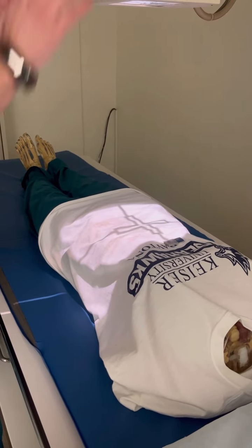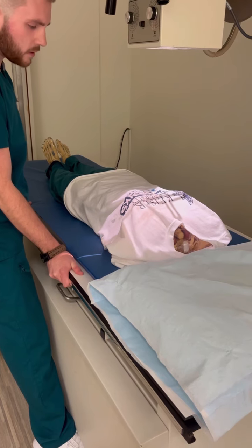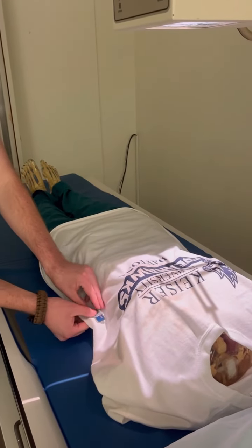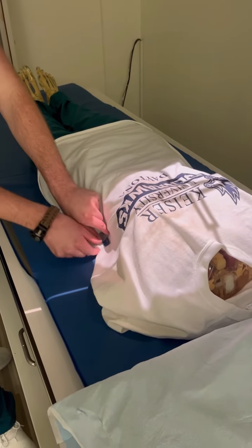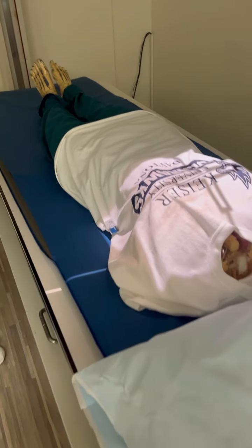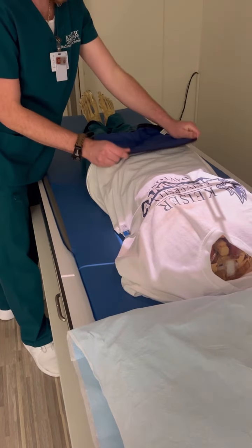And what I'm going to do, I'm not moving this or the IR, but we're just going to move Miss Pat down. So about, I think that'll be good right there. Take the marker, put it in the corner of the light field here. Flat so it actually shows up. Maybe we could ball it up there. That should be good. Okay, so we'll give the patient the same set of breathing instructions, and I'm going to grab the shield tube since we can cover her gonads because it's not in the picture anymore.